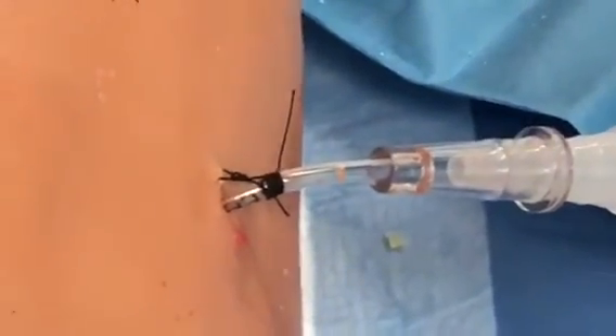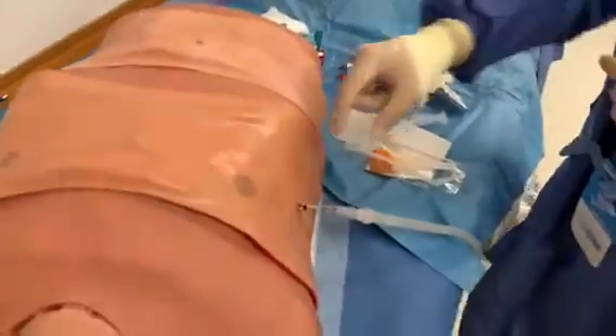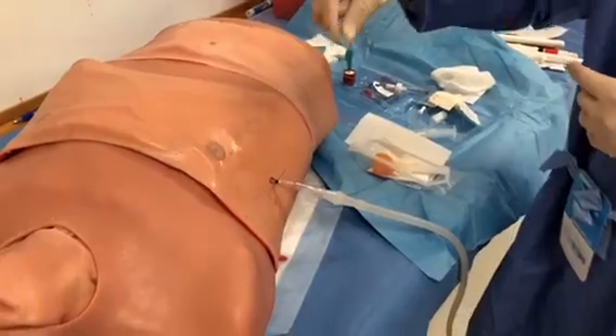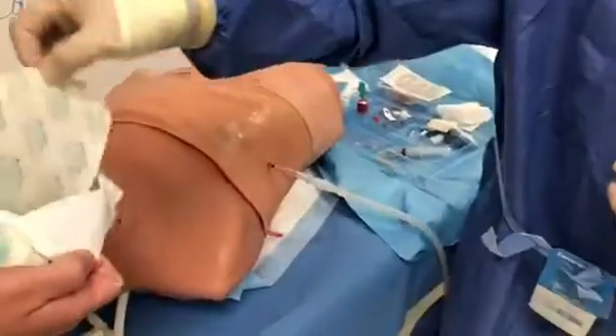It will be very hard to pull out. You have the tube almost to the hub — probably about three centimeters outside. For 12 French, you can actually go in all the way to the hub and that will be fine. For 16 French, you want to be at around 18 cm — around 18 would be a good marking.